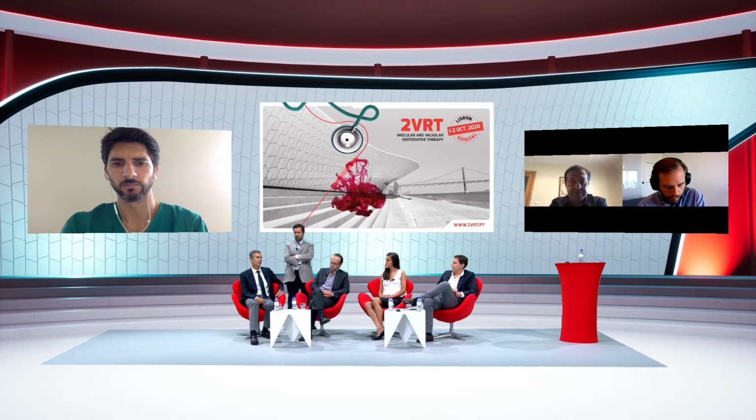In the second case, I also had a rupture of the aorta, but fortunately it was on the abdominal aorta and not on the thoracic. We were first able to put a balloon just to stop the bleeding, and then to implant a covered stent. We used a balloon expandable stent, not a self-expandable. I would love to have this in the cath lab, immediately available. In our case, we had to crimp the stent on the balloon, so it takes some time before we can do that.